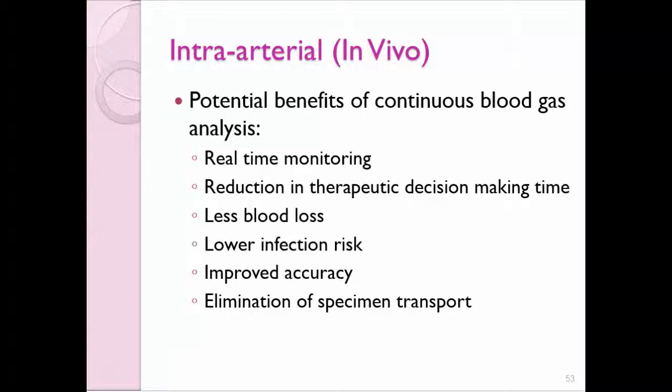You have less blood loss. You have lower infection risk because you're not having to puncture them as often. It has improved accuracy and elimination of specimen transport.